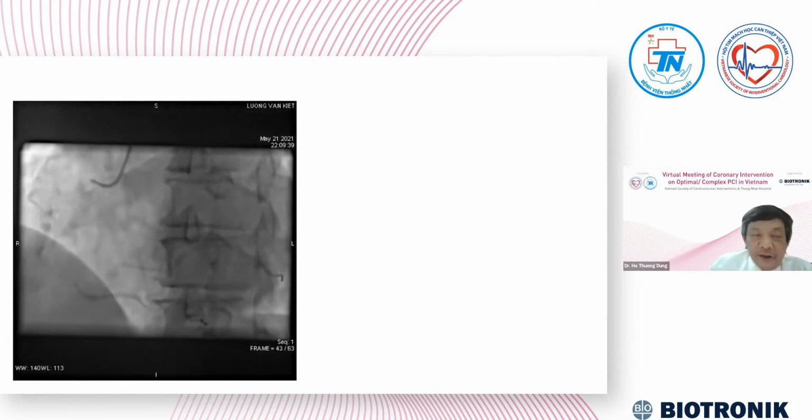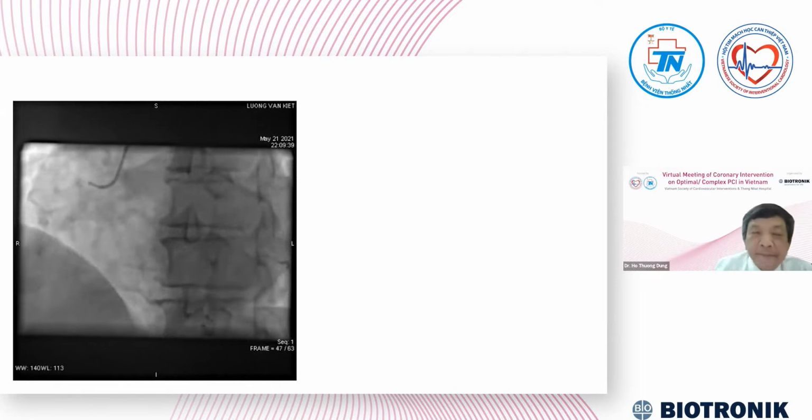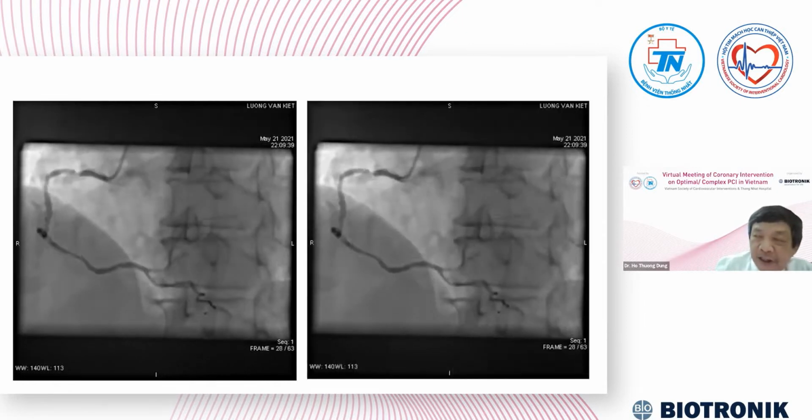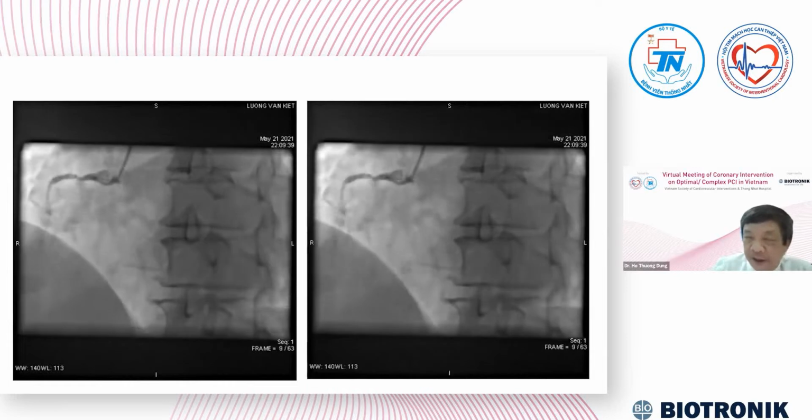And the severe tortuous calcified lesion in the proximal, the mid segment of the RCA. And the right coronary artery gives the collateral blood flow to the left, very abundant.